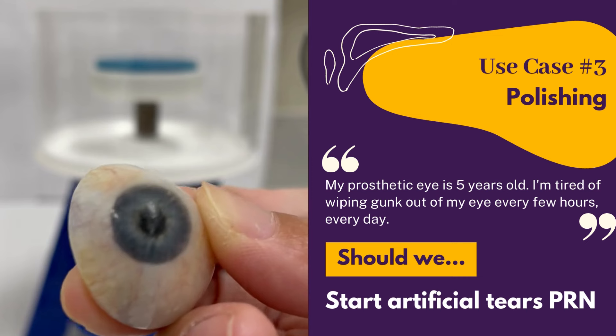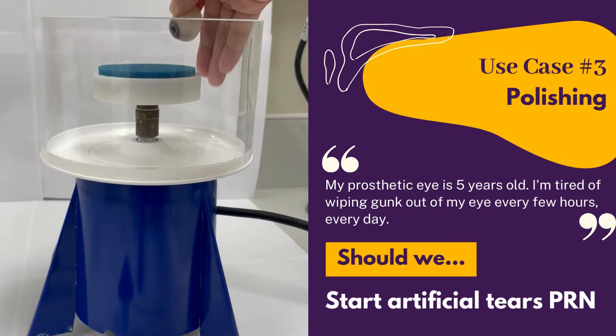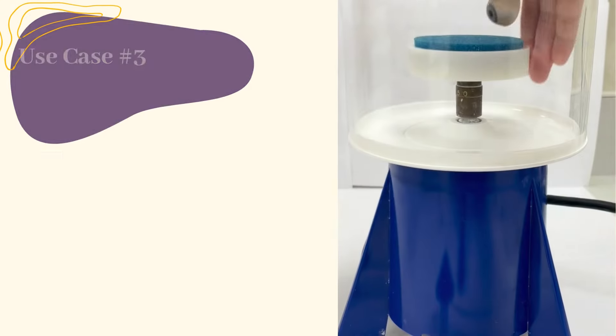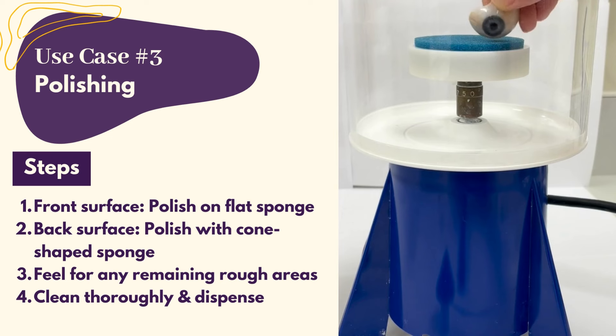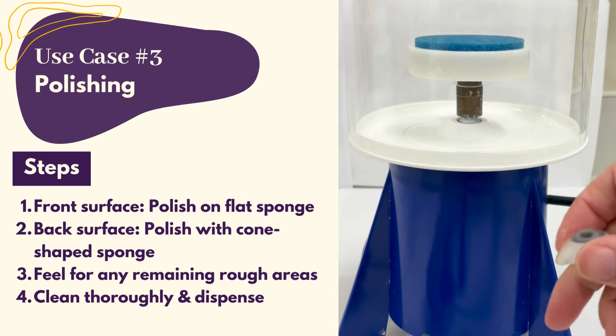Case number three is polishing. Besides lenses, we polish patients' prosthetic eyes. We recommend polishing every six months to improve wetting and reduce discharge, because artificial tears can't solve everything. Most prosthetic eyes are made from hard acrylic. Simply polish the front surface on the flat sponge, then polish the back surface with the cone-shaped sponge.